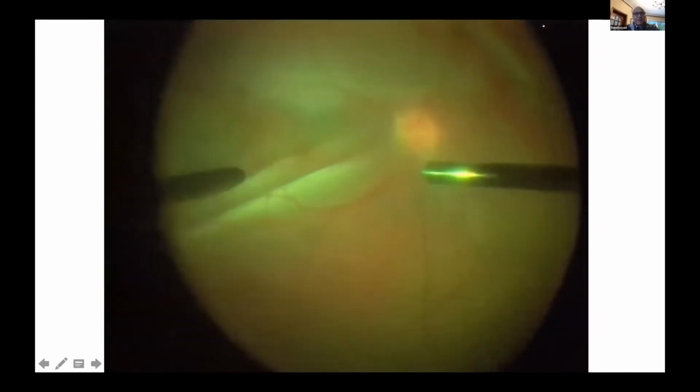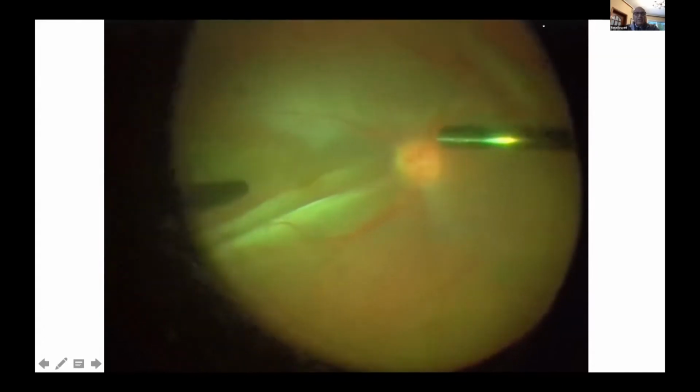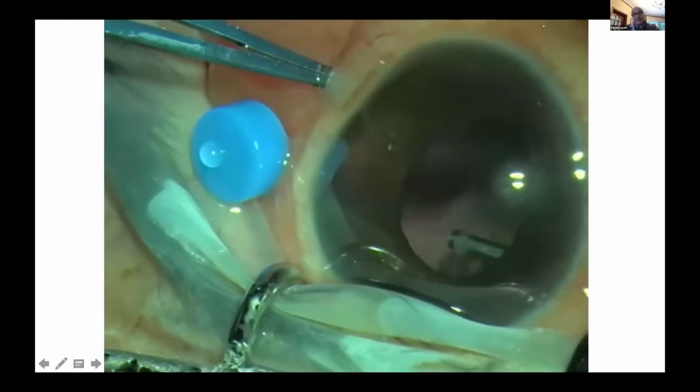Once I aspirated, finally, I could see the optic disc. There is retinal incarceration. What that means is that those folds are a sign of retinal incarceration posteriorly. This area is a diffuse chorioretinal scar temporally.